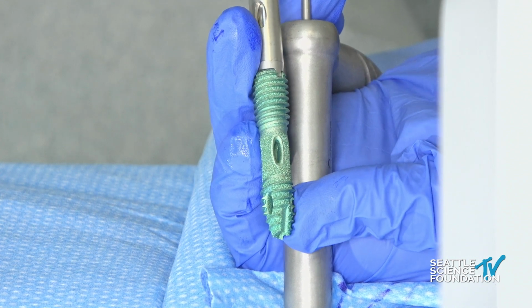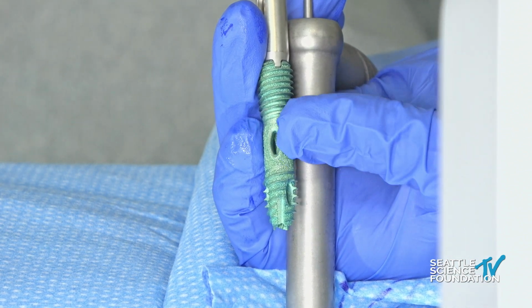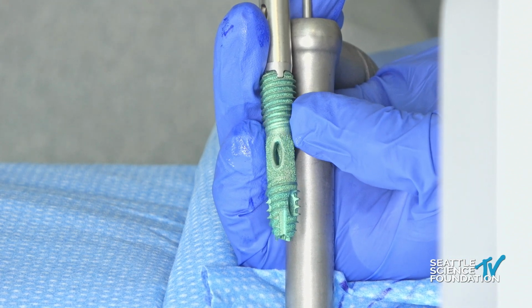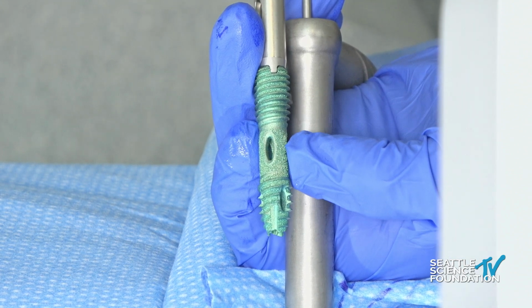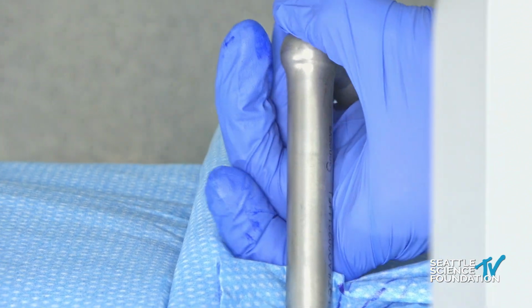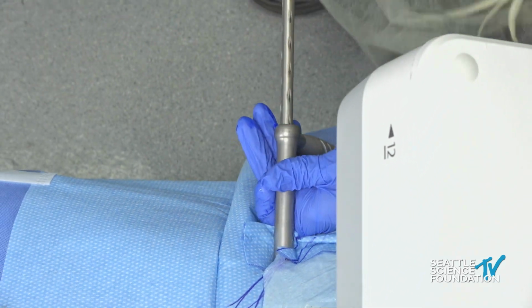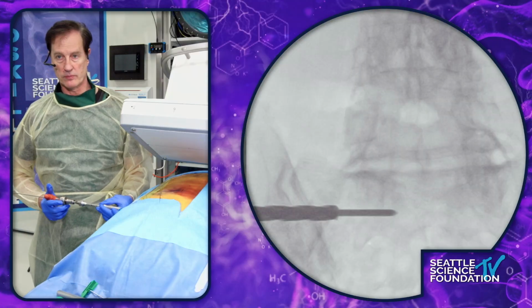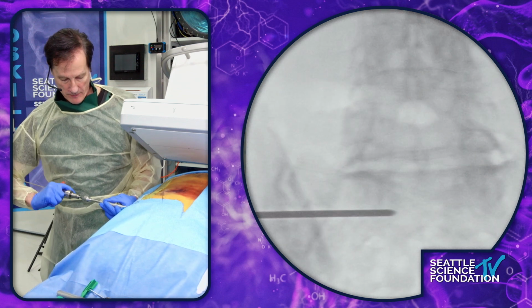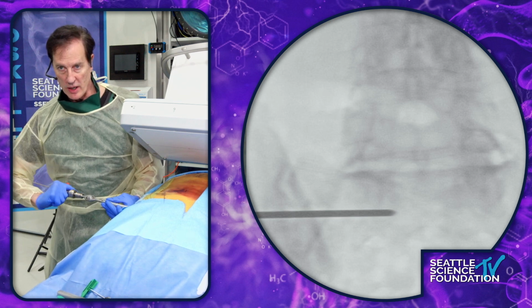The oval windows allow for through growth in addition to the on growth from this roughened surface. And this roughened surface has nodules here that are about the same distance apart as the cancellous bone. So we'll place this over the Steinmann pin. And we will start placing it across the ilium, across the joint.